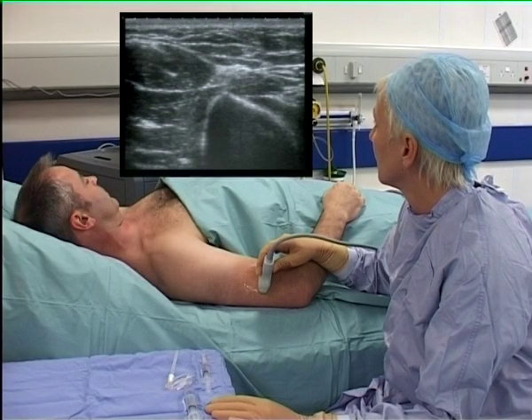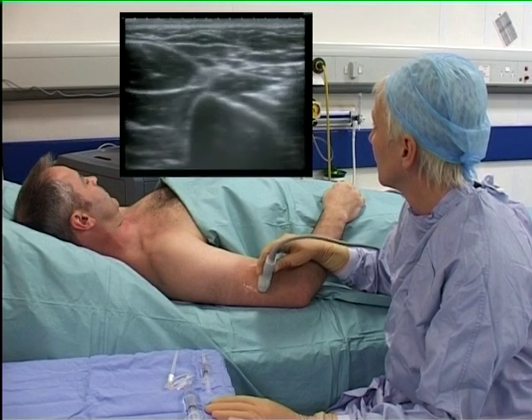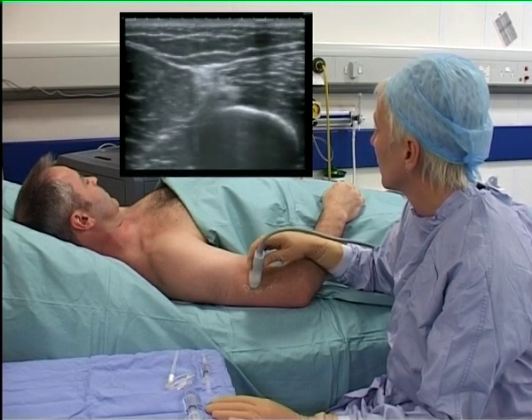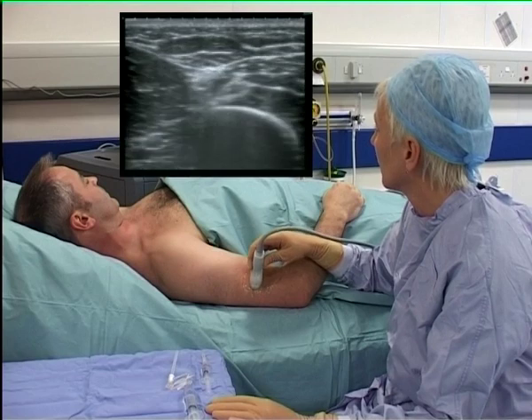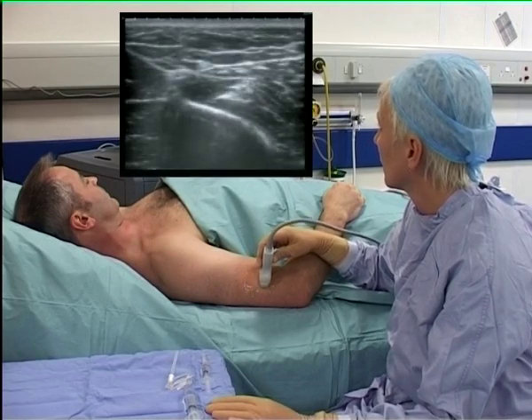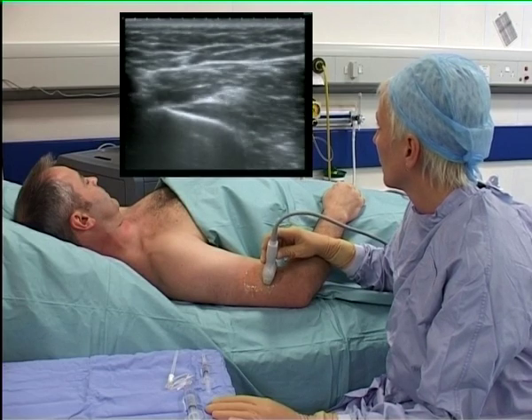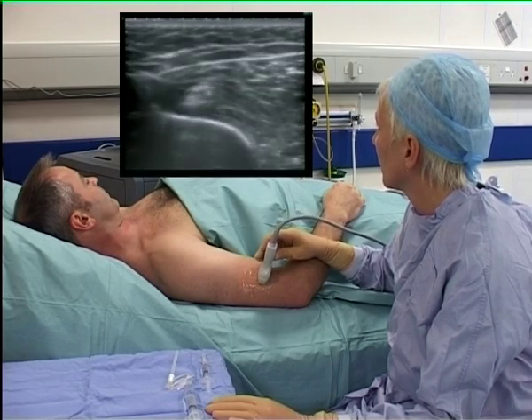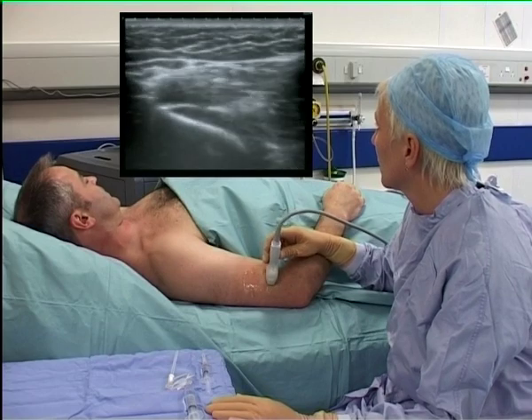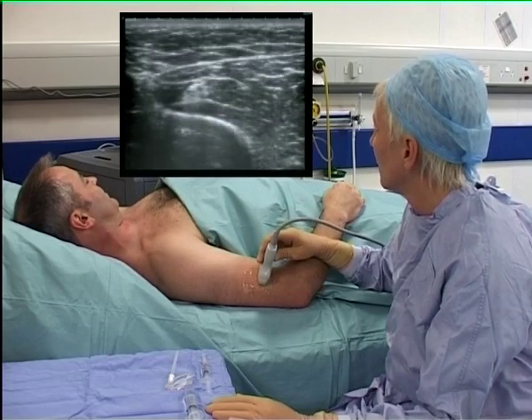Moving the probe up and down at the lateral aspect of the lower part of the upper arm allows identification of the radial nerve. It has a hyperechoic appearance with a honeycomb pattern. Approximately, it lies adjacent to the humerus, which is the homogeneously dark structure with a bright white line in the left lower part of the image.